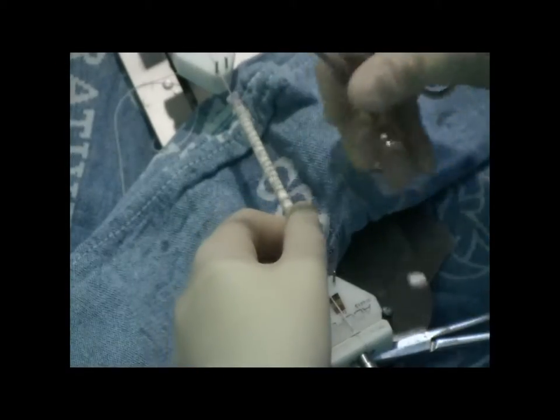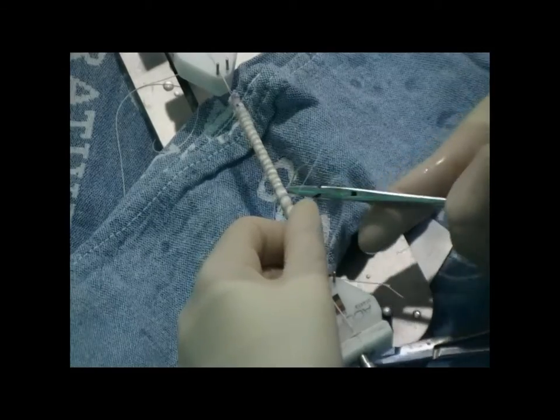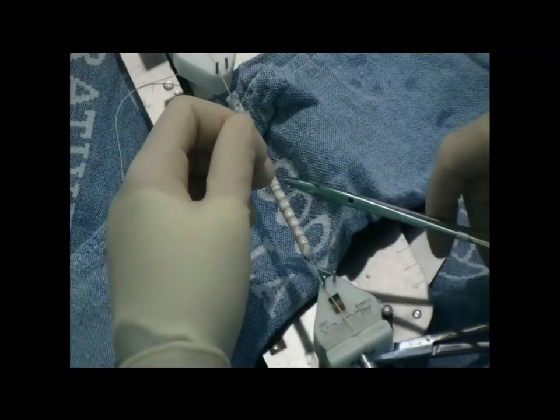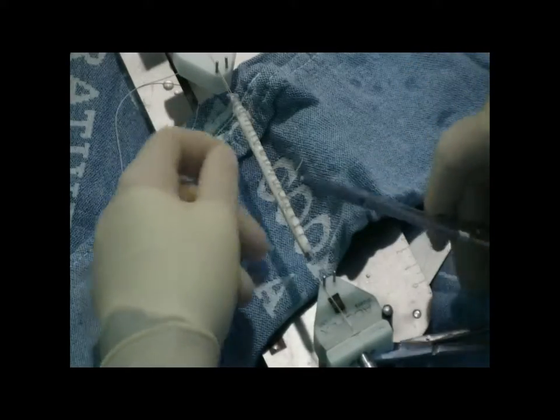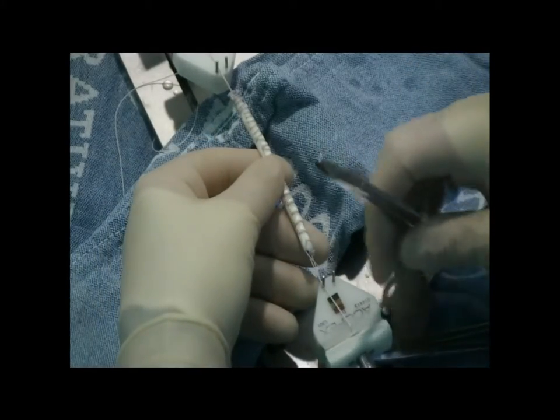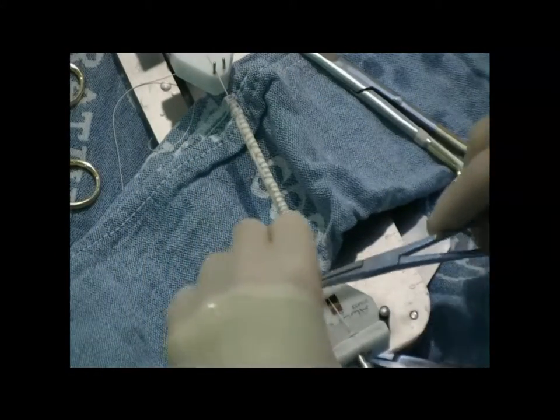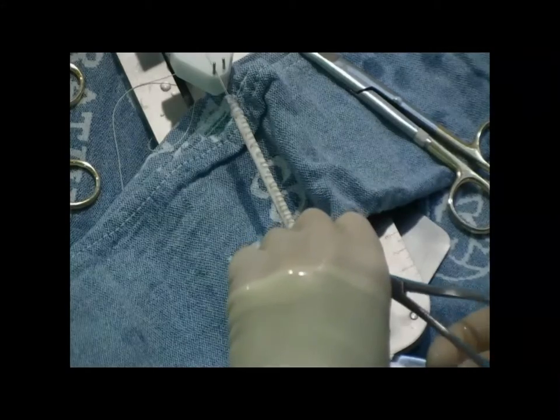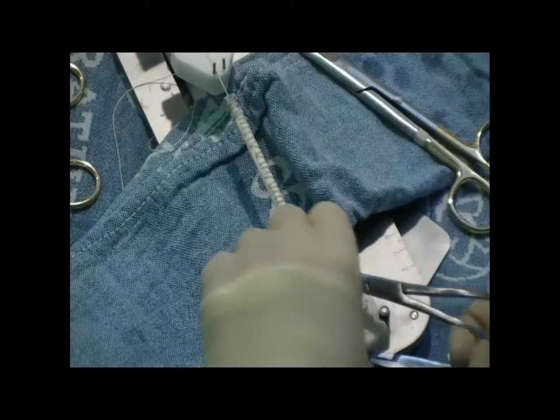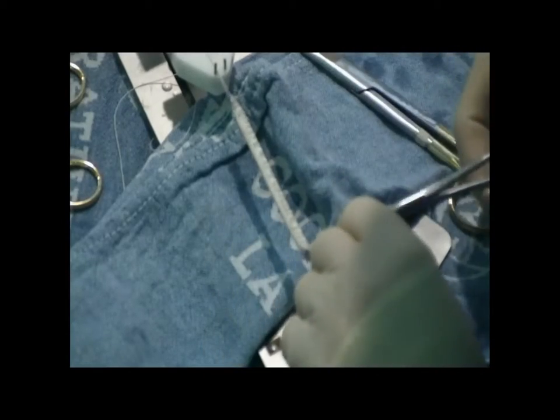This suture then goes from one end to the other and then it's tied to itself — then you have your finished graft product. I have experimented with several different grafts through time. I have found fascia lata to be the more durable of the grafts that I've worked with, the least prone to swelling and fraying inside of the joint. But I can't emphasize enough how important it is to be very highly meticulous with your graft preparation.